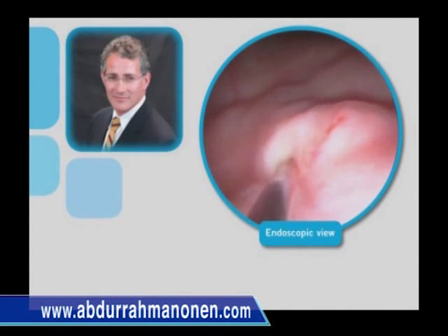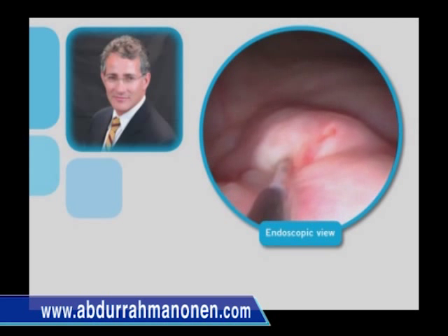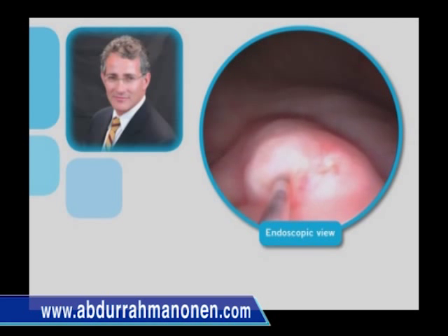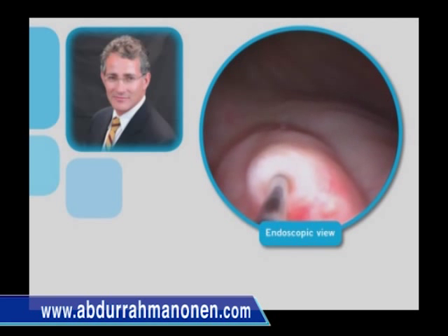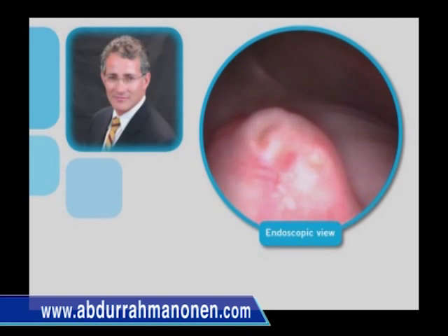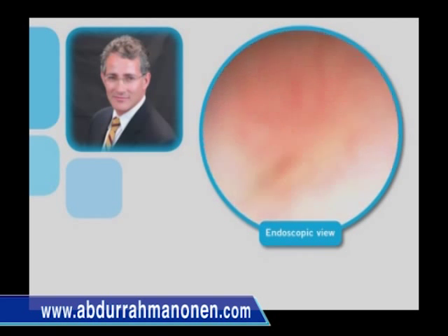Once the needle is in position, hydrodistension is stopped, and a very slow injection is performed without placing strain on the ureteral orifice. As the injection proceeds, the ureteral tunnel will be noted to rise first distal to the site of injection, and then proximally with further injection. It is important to note that when the orifice is in close proximity to the lower pole orifice, as shown here, injection of the lower pole will coapt the upper pole by virtue of this proximity.